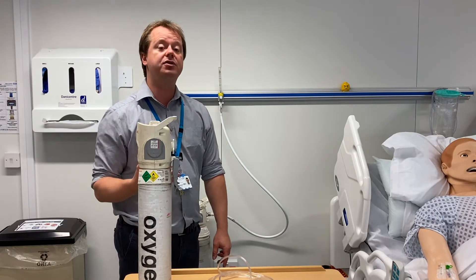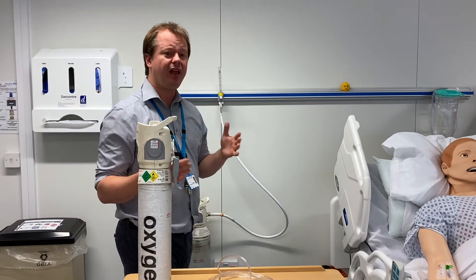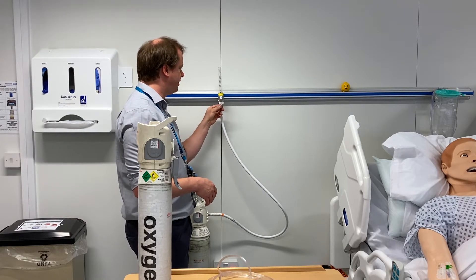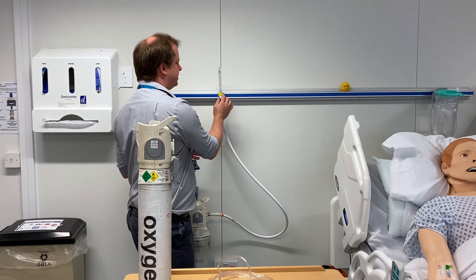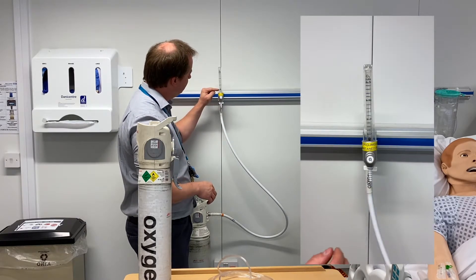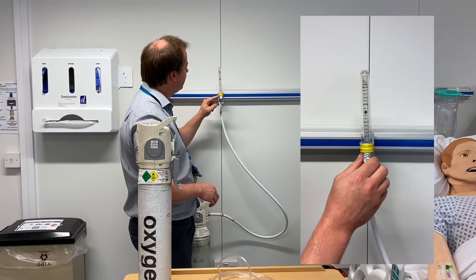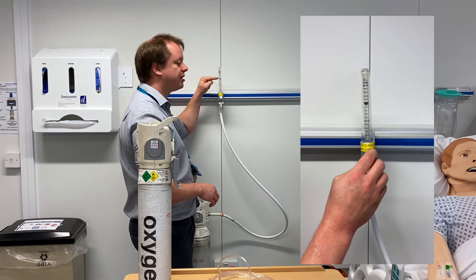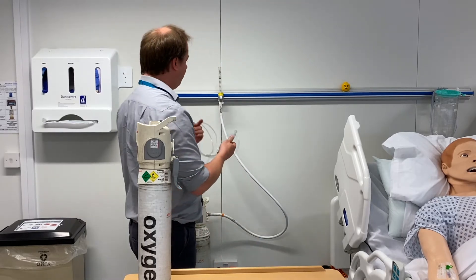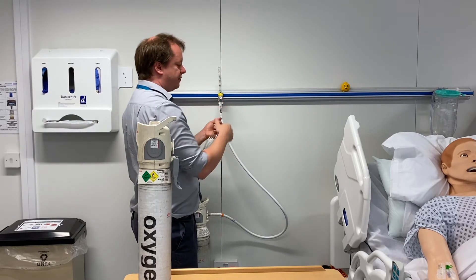Wall oxygen comes through a valve like this, which has a fir tree valve on the bottom. It works simply by twiddling a knob on the side to give you the flow of oxygen you want. You'll know which flow you're giving the patient because there's a little ball inside which rises depending on the flow rate. For example, setting to 10 litres per minute, you make sure the ball aligns with the 10-litre mark, and then you connect your oxygen delivery device.